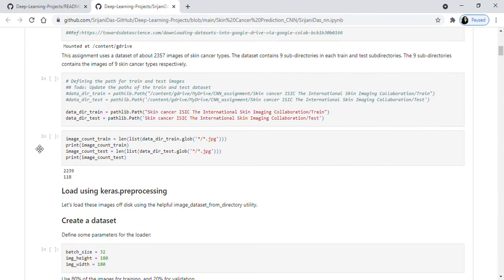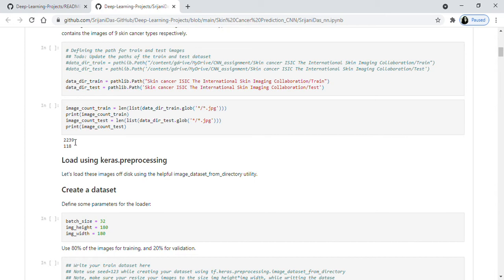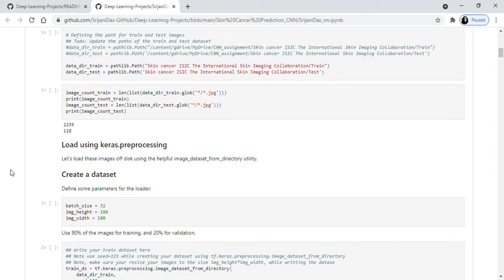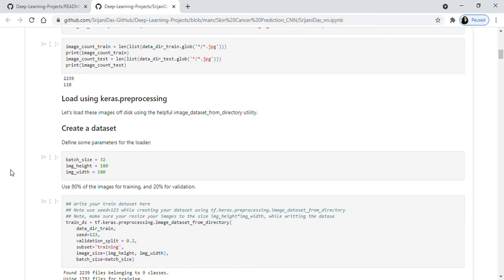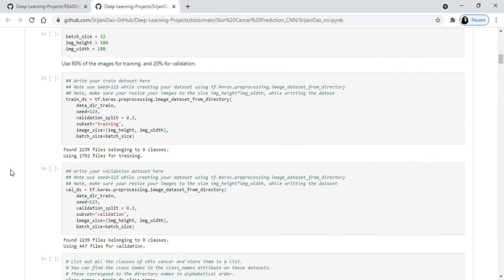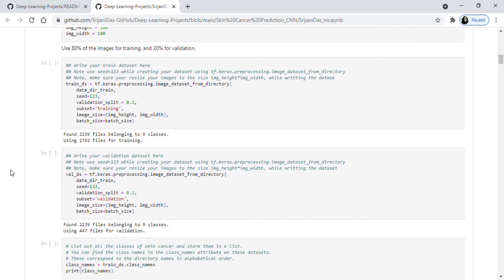As you can see, we have used TensorFlow and Keras for our neural network part. Here are our train and test data, which is basically a bunch of images of skin and some marks on skin. We have around 2200 images for training and 118 images for testing. We cannot use these images directly — we have to create a dataset from them using keras.preprocessing.image_dataset_from_directory. We give the directory location and it generates the dataset. We do the same for validation data as well.